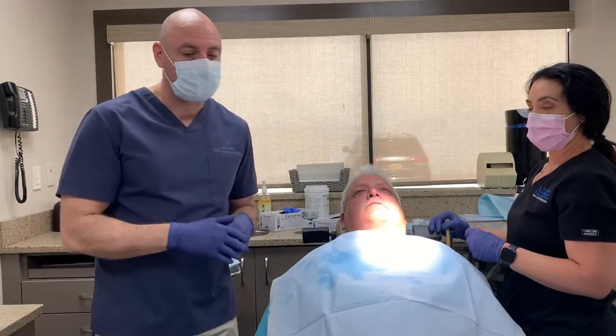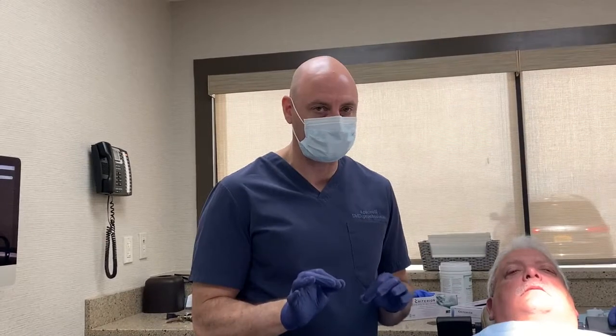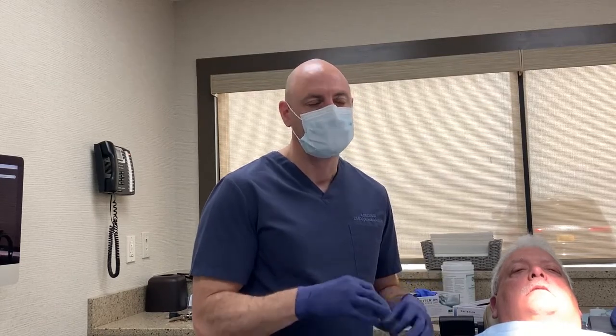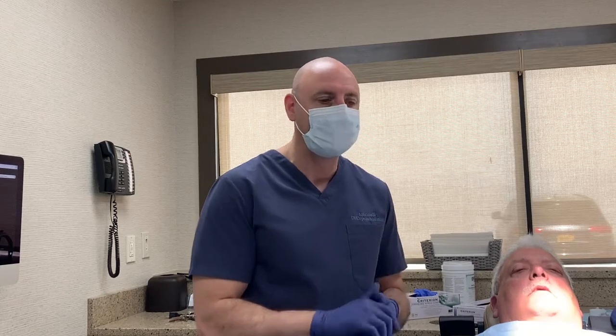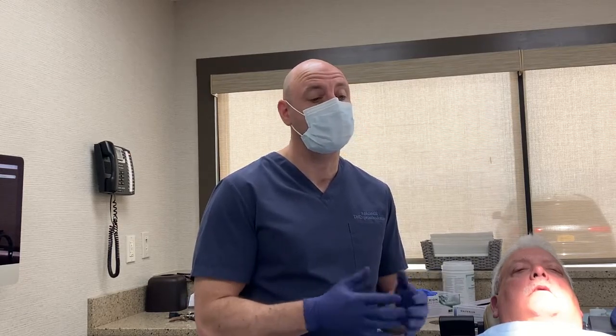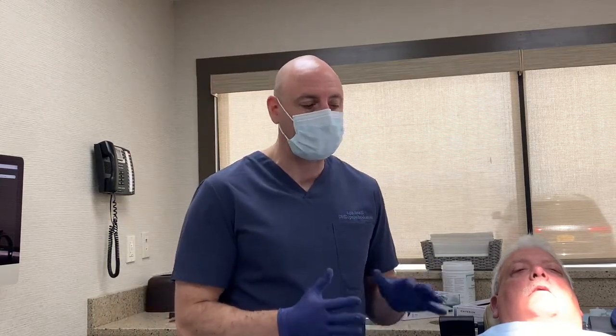You asked me what the maintenance protocol was. So my maintenance protocol, first of all, I never do anything all the time. In general, for my fixed screw-retained implant prostheses, I have the patient practice appropriate home care, and go over that with the patient at delivery. Then I will see my patients at a minimum biannually, so my hygienist can clean the prosthesis. I do not remove the prosthesis, because if you remove it, which is totally fine, it takes time, and ideally we need to replace the prosthetic screws, because we torque them to the manufacturer's recommended torque. Once you do that, technically the screws are fatigued. So if you're going to remove it, you should really get new screws, unless you want the patient to incur a decent fee, and it takes up your time as the clinician, because I'm not going to have my hygienist do that. I like to just keep it in the patient's mouth.